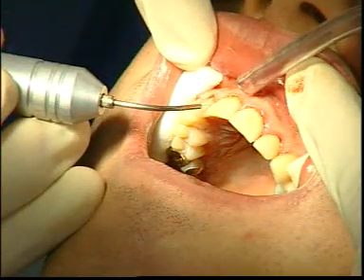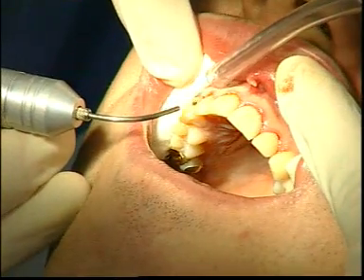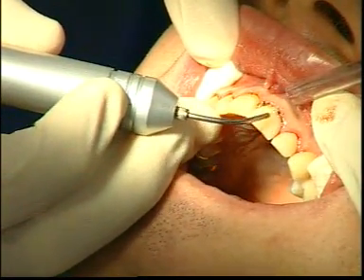Further modulation of the outer contours of the gums is part of the treatment. Unlike conventional periodontal surgical procedures, laser periodontal treatment is blood-free and does not require suturing or periodontal dressings.